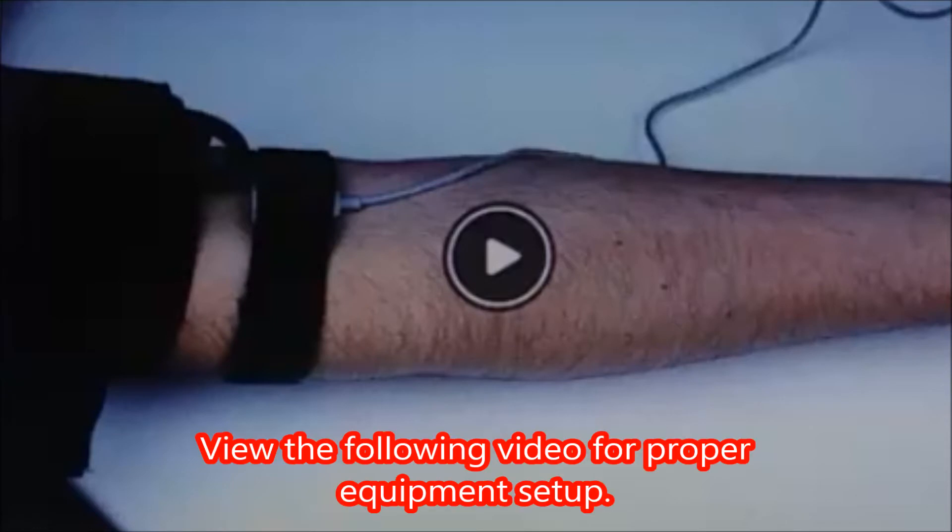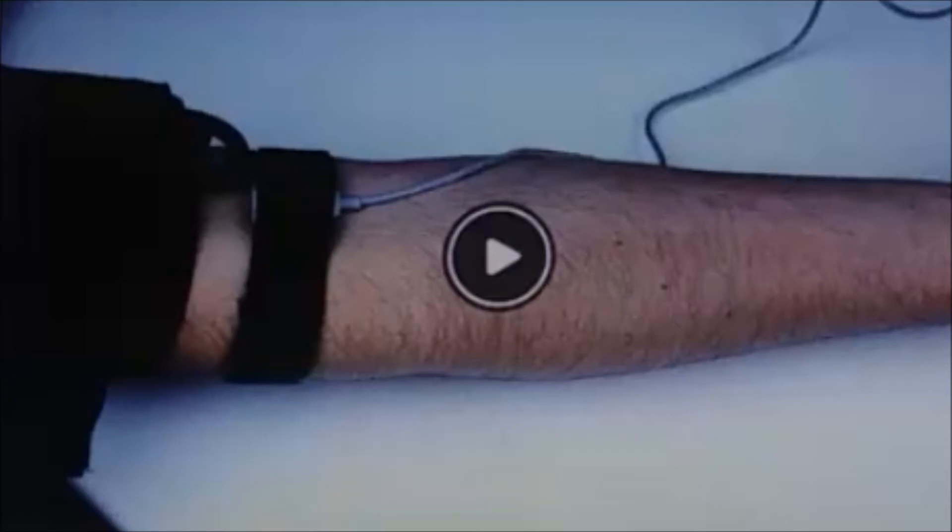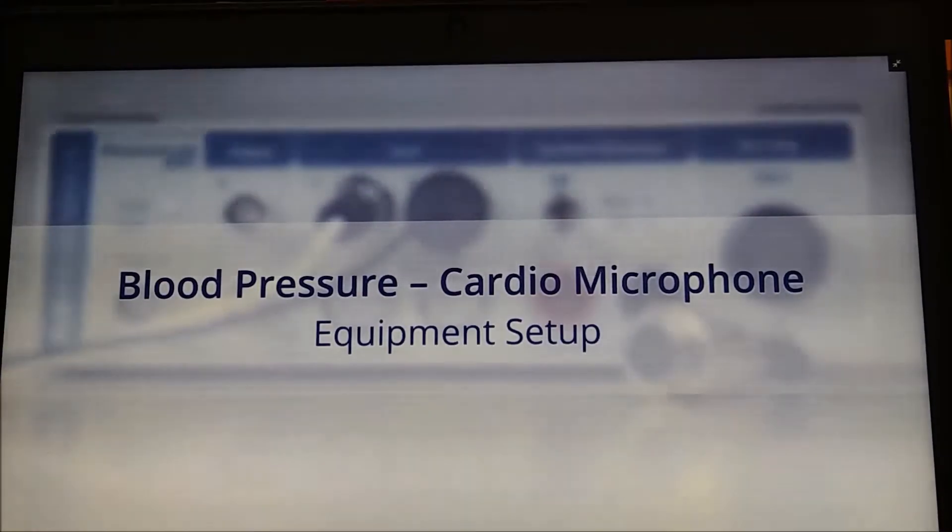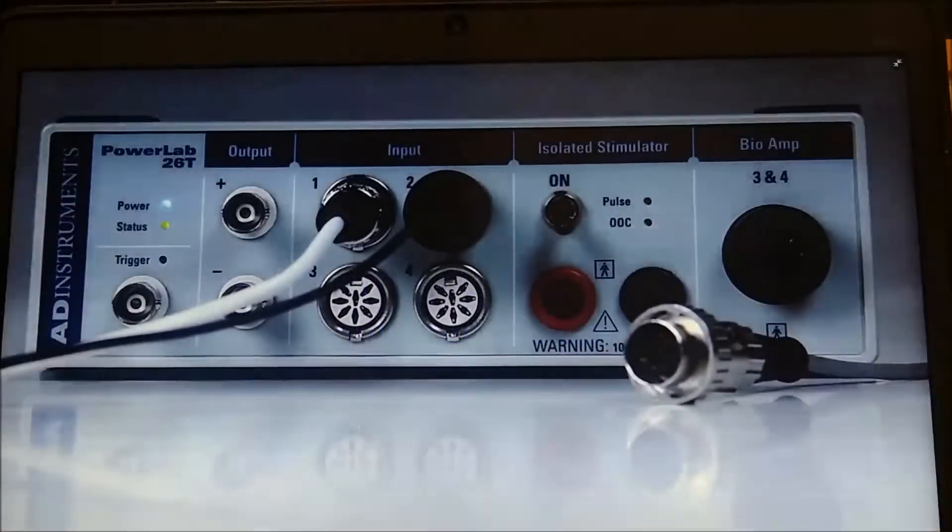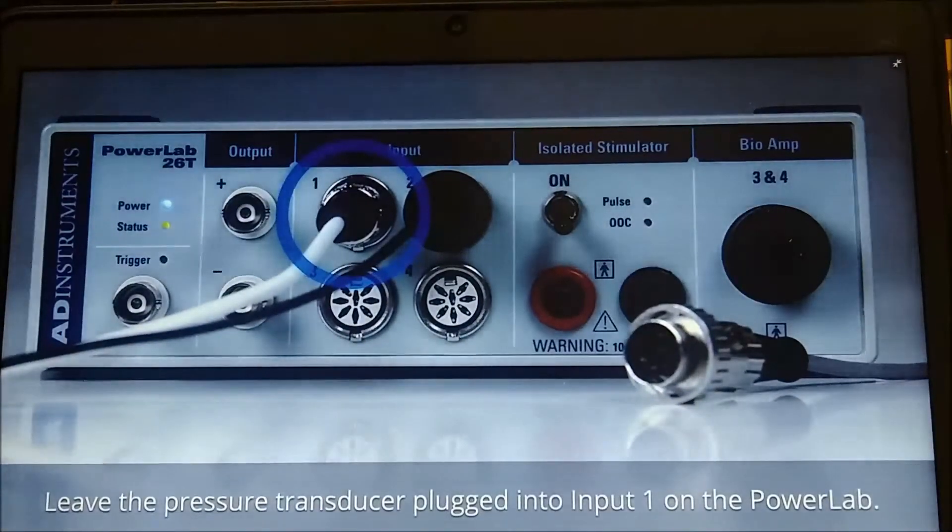View the following video for proper equipment setup. Blood pressure cardio microphone equipment setup. Leave the pressure transducer plugged into input 1 on the PowerLab.